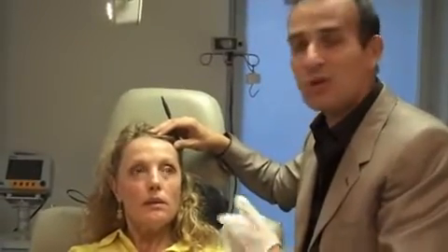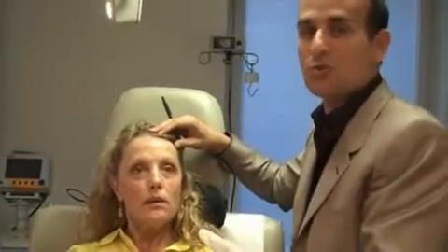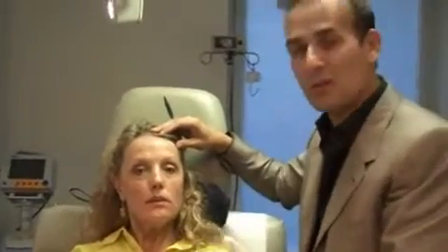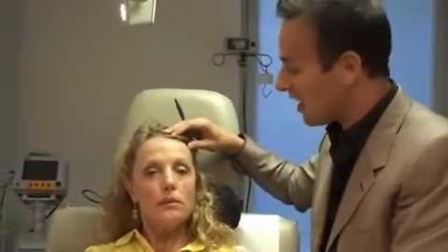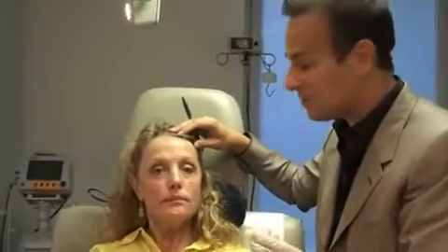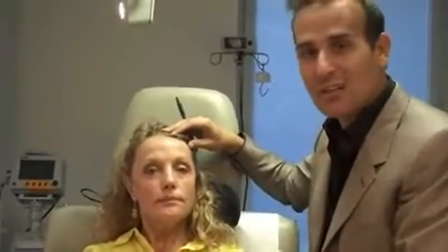My general rule is you could always do more. So the goal is to have a natural result and a safe result. So I always start with a certain amount. As we get more comfortable with the patient and we take a look back in a week's time, we can always decide if we want to add to certain areas. But as you can see, this is a non-invasive facelift, doing things that you actually can't do with surgery.